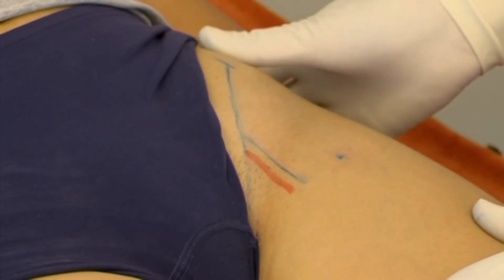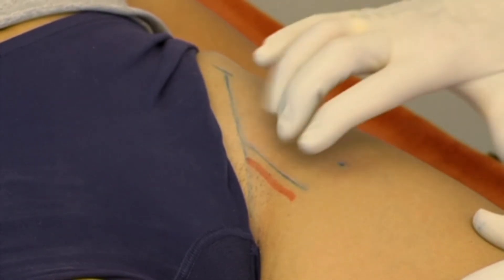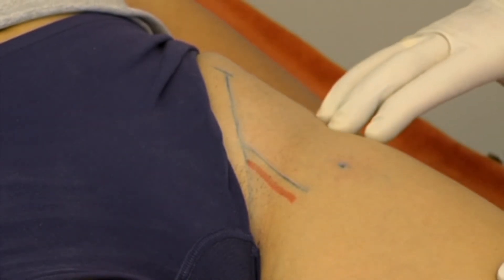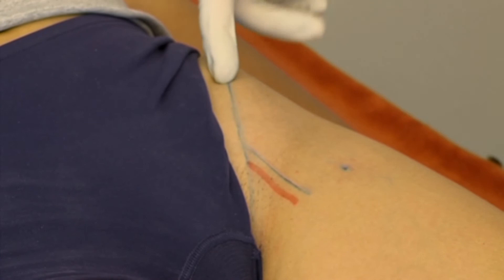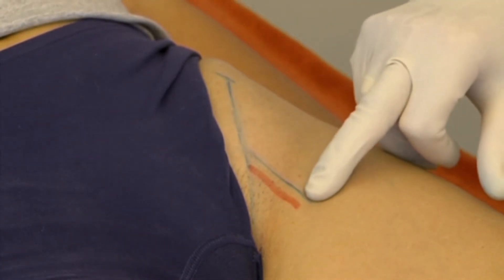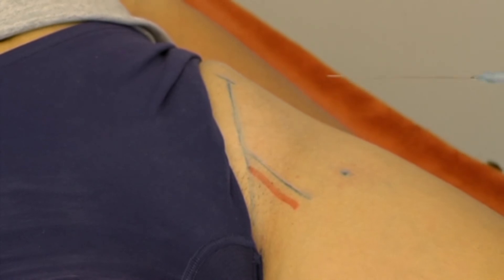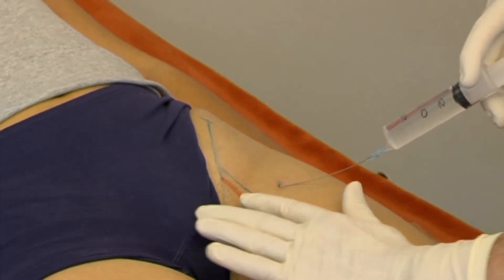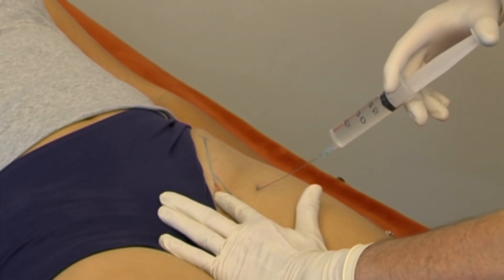We palpate the anterior superior iliac spine and the femoral artery. The femoral artery and nerve are avoided by choosing a point well lateral to the midpoint of the inguinal ligament and 5 cm below it. The needle is inserted under an angle of 45 degrees in an upper inner direction, while we check the pulsations of the femoral artery.